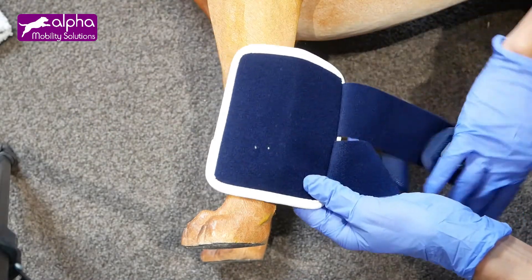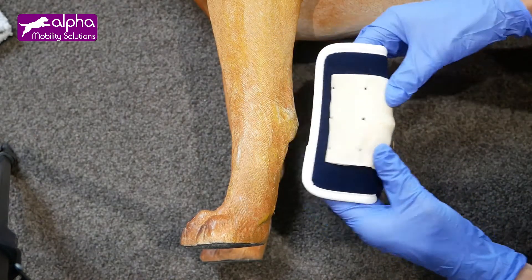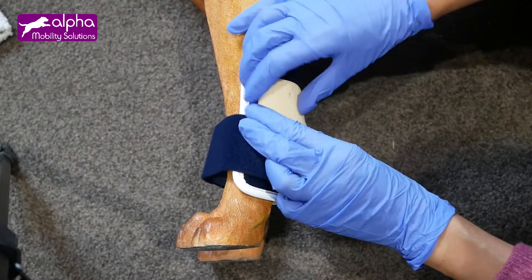Now you can use a leg wrap to hold the splint. Place the tailor-made splint above the wrap to make it comfortable against the skin. Then close the straps above the splint to hold it in place.